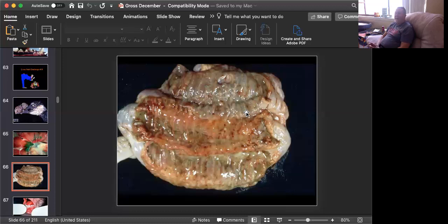An EM of that lesion in non-human primates shows the entire surface colonized by these spirochetes, which are standing on end. I don't know how the animals digest anything, but this is a great picture of swine dysentery, Brachyspira hyodysenteriae, or now hampsonii.